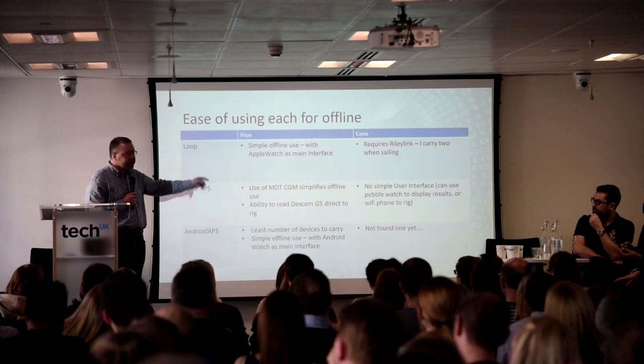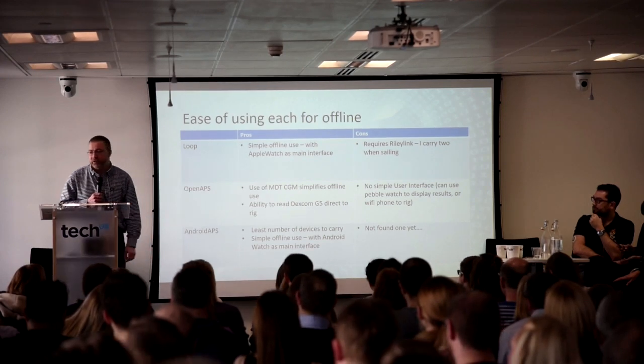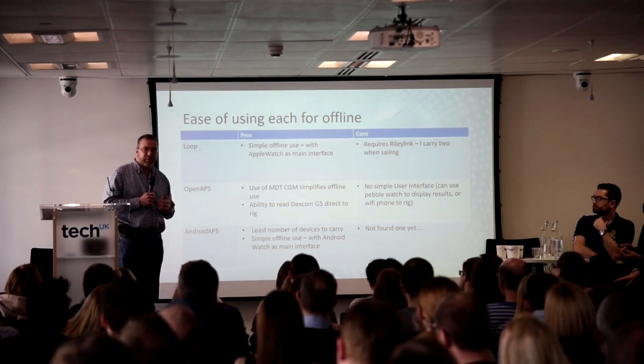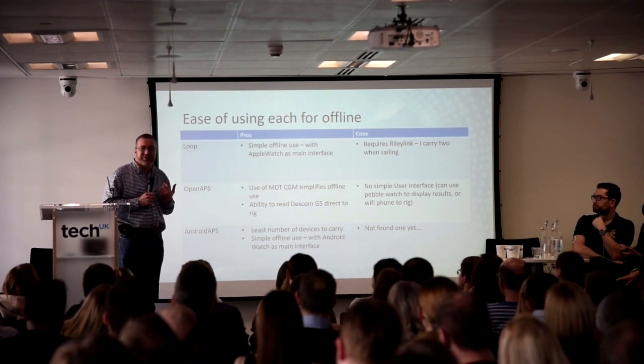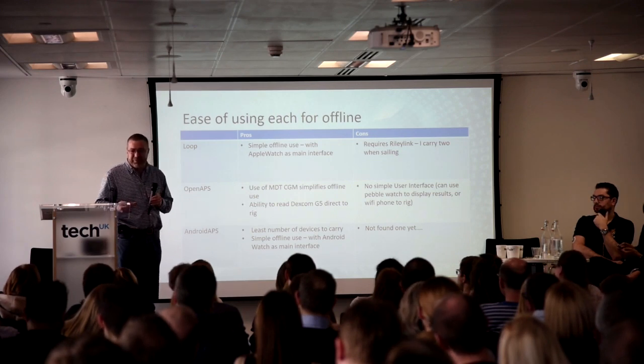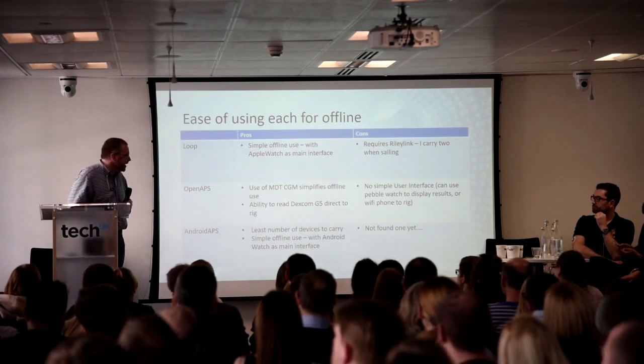And the great thing is, you've got the Apple Watch as the main interface. It's probably worth saying why I want to have that interface. When I'm offshore, I'm under 5 layers potentially of clothes. Trying to get to a pump, to fiddle around with a pump and play with the buttons isn't very easy. Can do it.